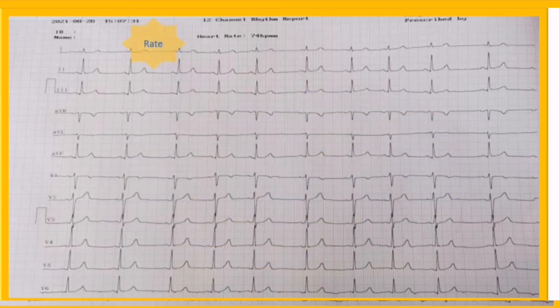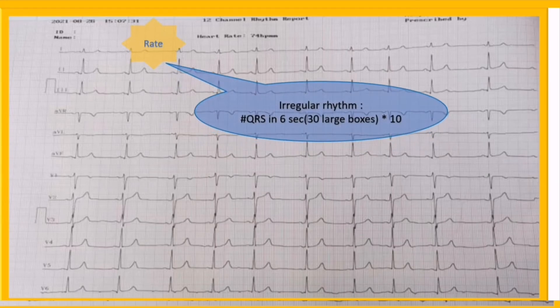The third step is calculating heart rate. There are several methods to calculate heart rate, which mainly depends on the underlying rhythm. If the rhythm is irregular, like our today's EKG strip, count the number of complexes within six seconds — that is 30 large boxes — and then multiply by 10.